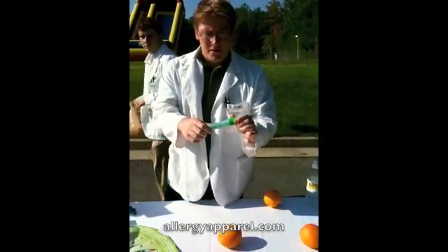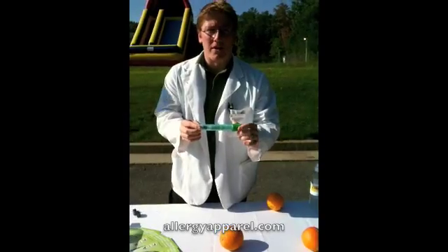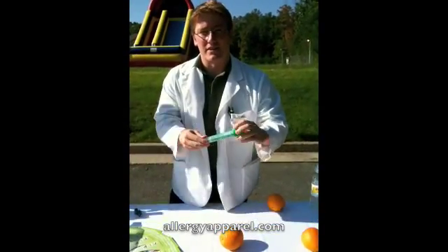This is a live EpiPen demo. This is an expired EpiPen — it is a real EpiPen that will actually inject the needle.